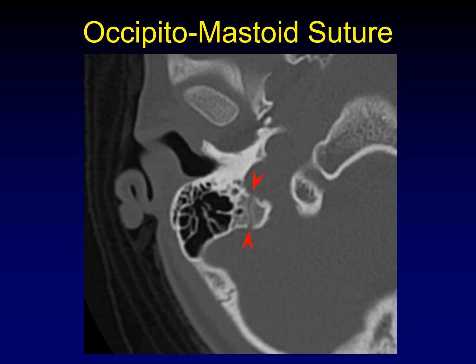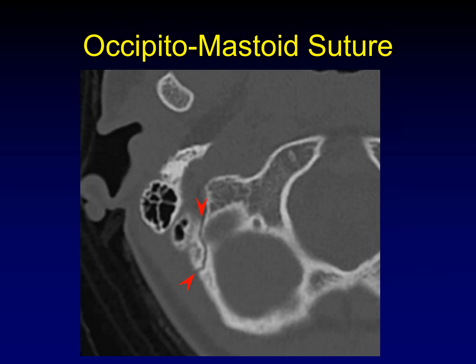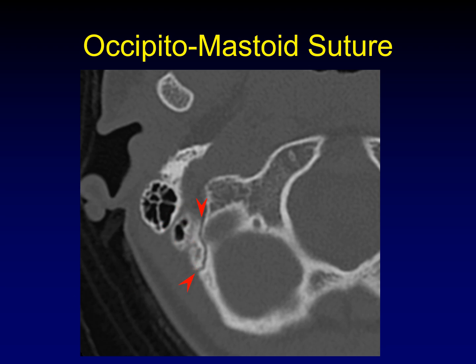Next is the occipitomastoid suture, and this one's a little tricky because it looks like you're just fracturing off a tiny little bit of bone here, but this is part of the occipital bone and this is part of the mastoid portion of the temporal bone — this is a normal structure. It extends back here, and you can see how that would be easily mistaken for an occipital fracture. This continues on and becomes the familiar lambdoid suture, extending all the way up the occipital bone to join its counterpart and become the sagittal suture.